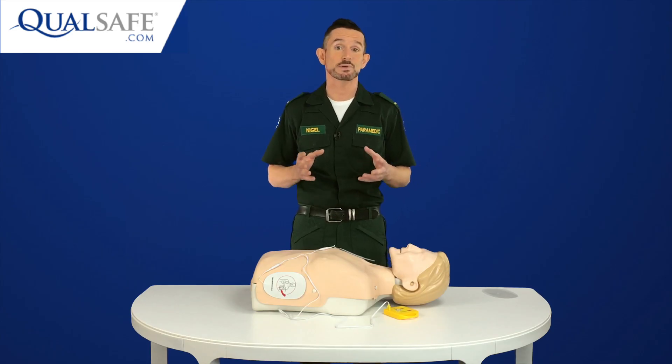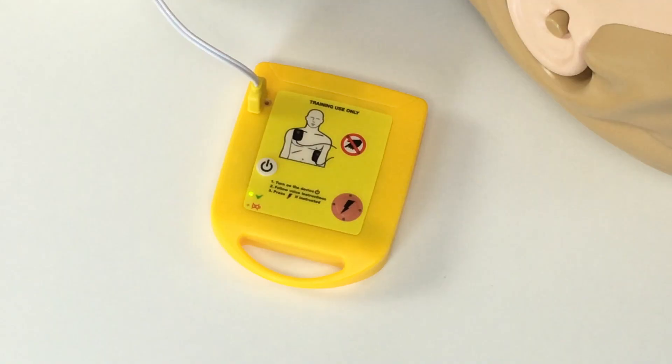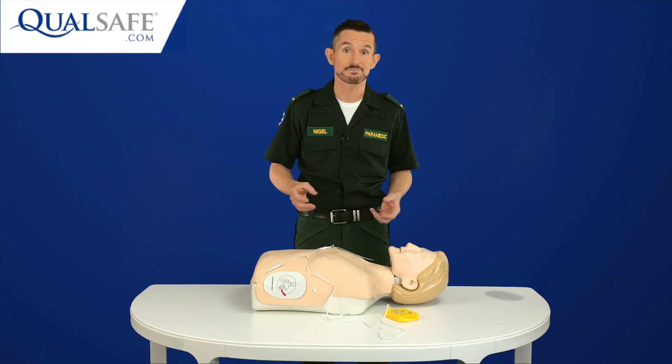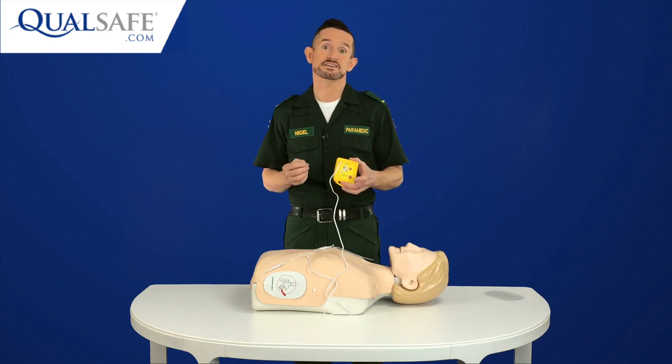After timing me doing two minutes CPR, the Mini AED Trainer does this: Analyzing heart rhythm. Do not touch the patient. No shock advised. If needed, start CPR. Which is great as it allows the learner to demonstrate following the AED both when it advises a shock and also when no shock is advised.